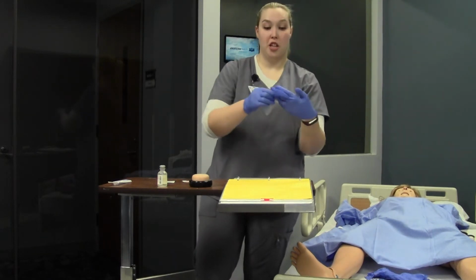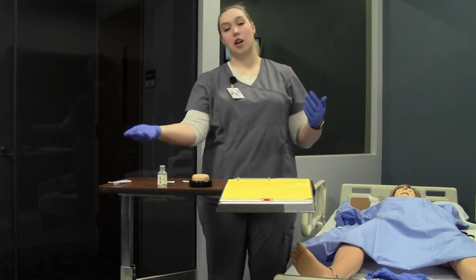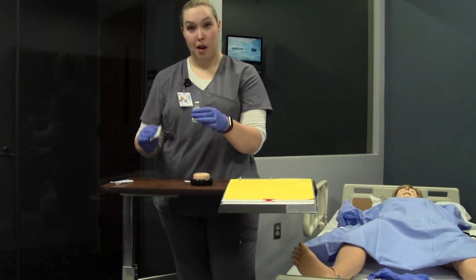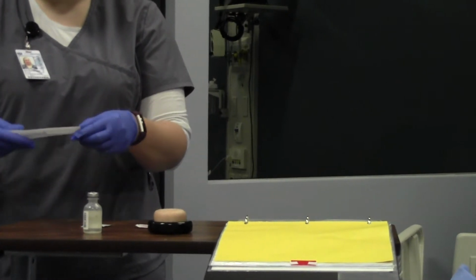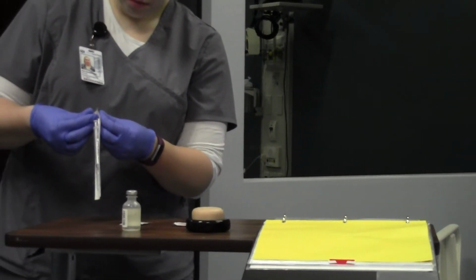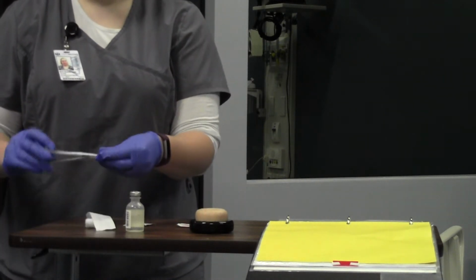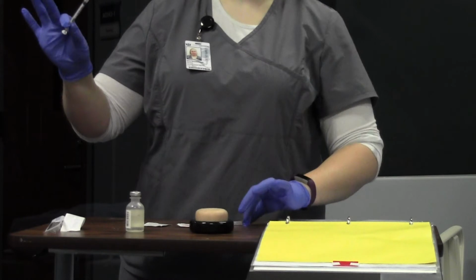You need to position your patient in the appropriate place, so bed at waist height, and you need to maybe have their arm just resting either on a pillow or the best position for you, because we're going to use our forearm. So I'm going to then go ahead and take an alcohol swab and clean the top of my vial. I'm going to go ahead and open my syringe. When I uncap, always pull away from me.